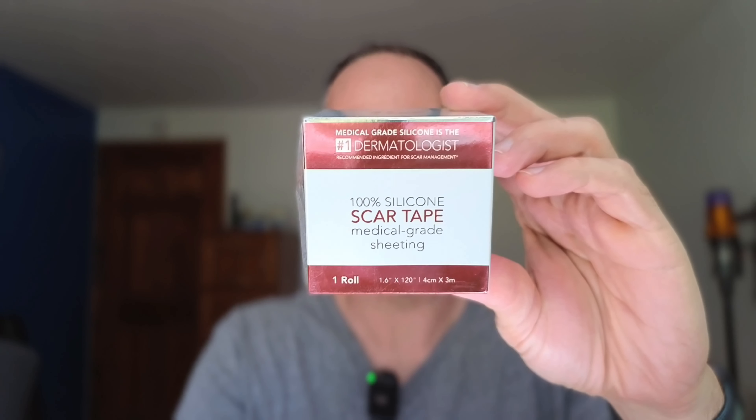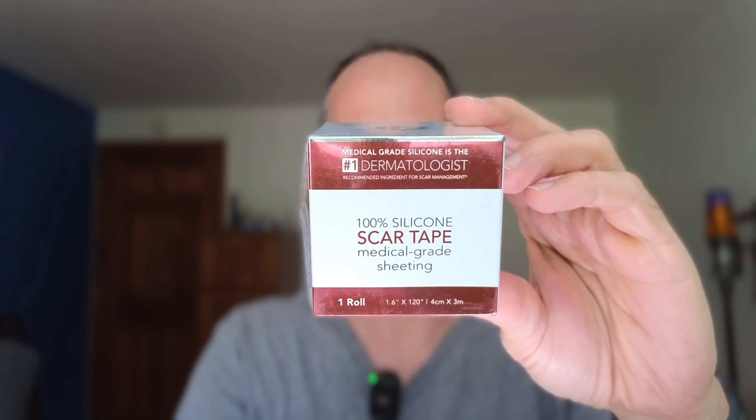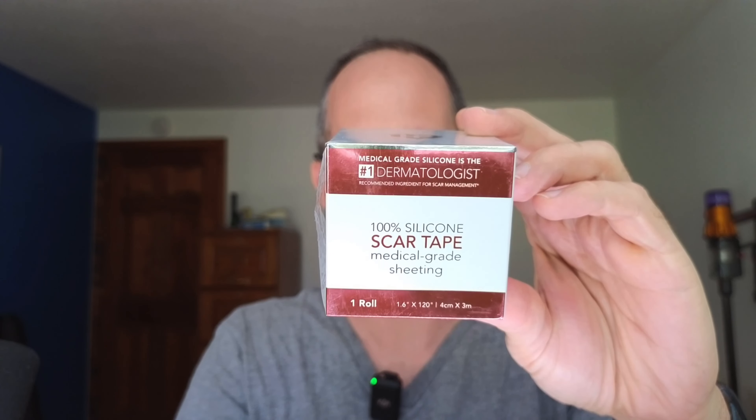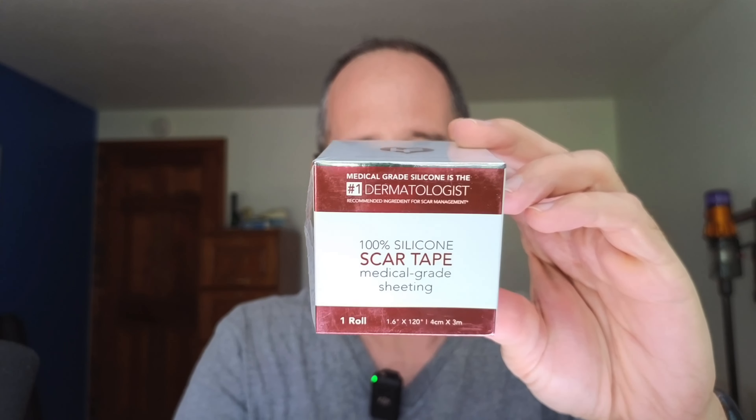Hey, it's Mike here, and today we're going to be taking a look at this 100% silicone scar tape. This is one roll, 1.6 inches by 120, or 4 centimeters by 3 meters here. This is something that the company actually sent me to review.